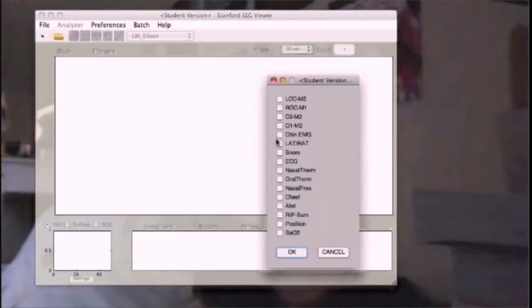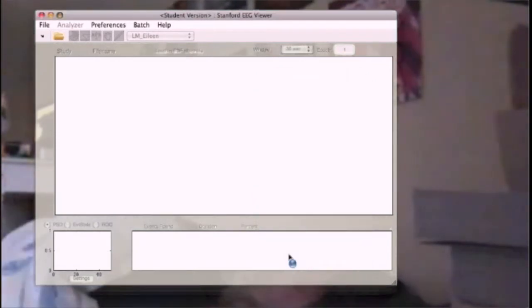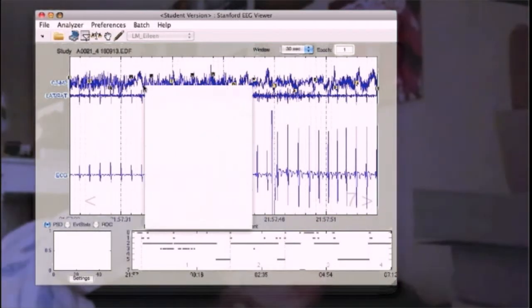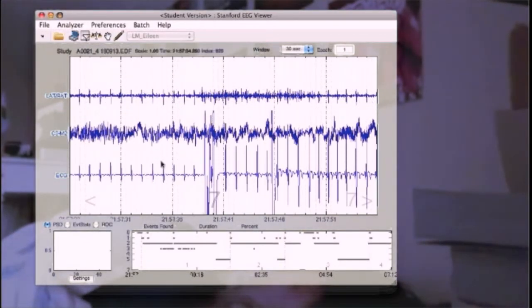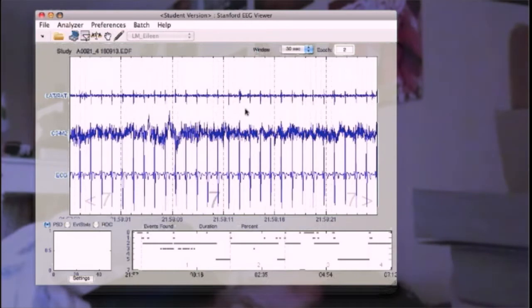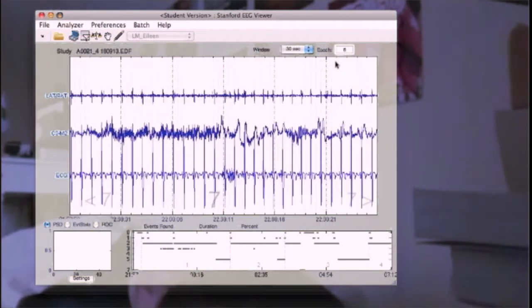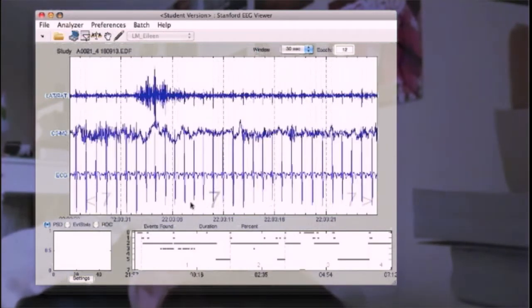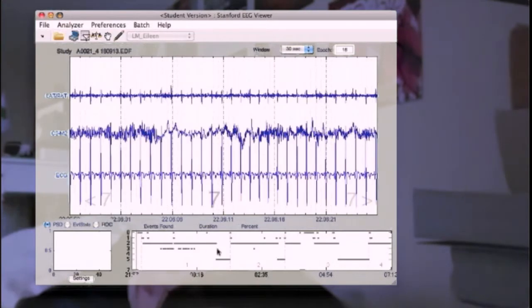A software solution designed to individually and holistically analyze a patient's sleep under numerous configurations and across large, diverse datasets has not existed until now. The Stanford EEG Viewer, or SEV, was created for this purpose.